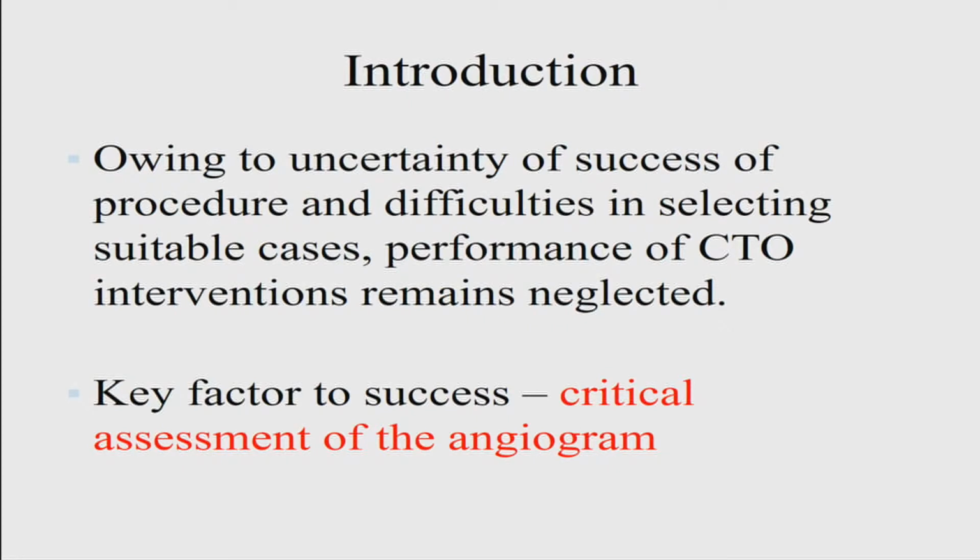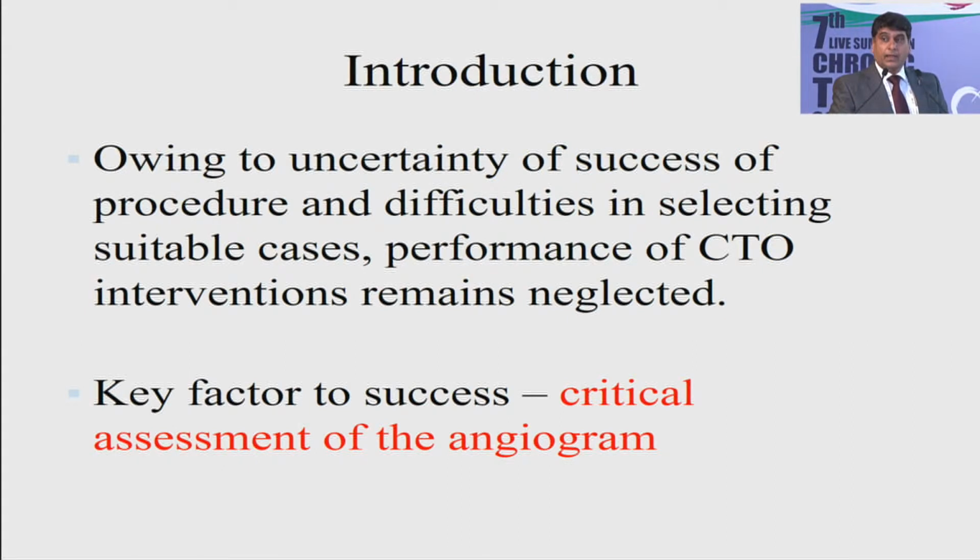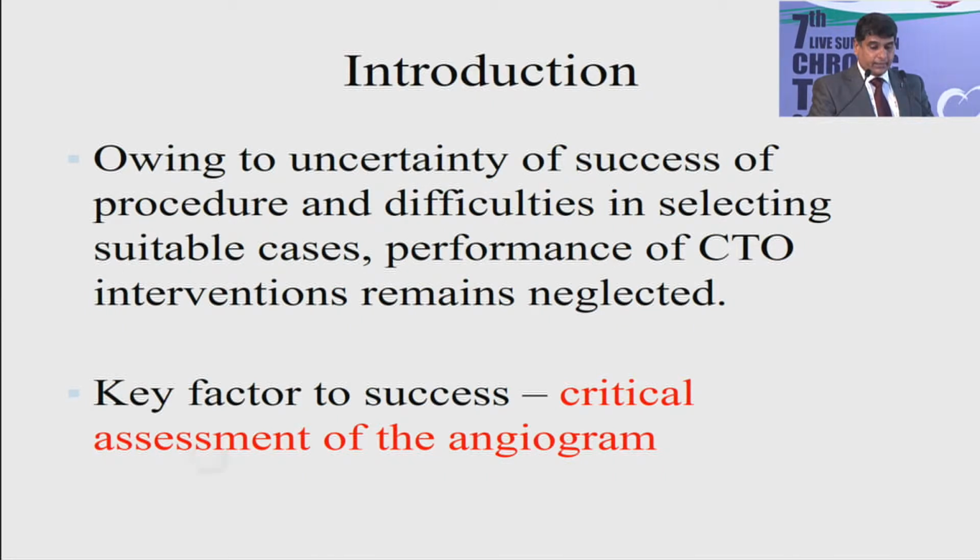We all know that angiogram assessment is an extremely crucial aspect of a CTO PCI, and quite a bit of time needs to be spent outside the cath lab rather than inside the cath lab to make this procedure effective and have a very good result at the end. Owing to uncertainty of success because of the CTO, there's quite a bit of apprehension in embarking on CTO cases. So most primarily, as Dr. Kumar mentioned, it's extremely important to clinically assess the patient, see if the patient would benefit from the procedure, and also enhance as much as possible the study of the coronary angiogram to be able to find a good result in the end.